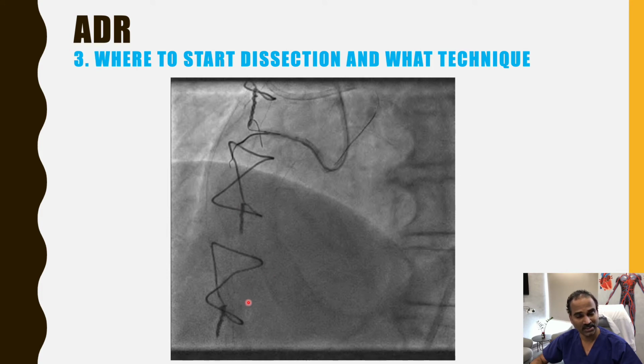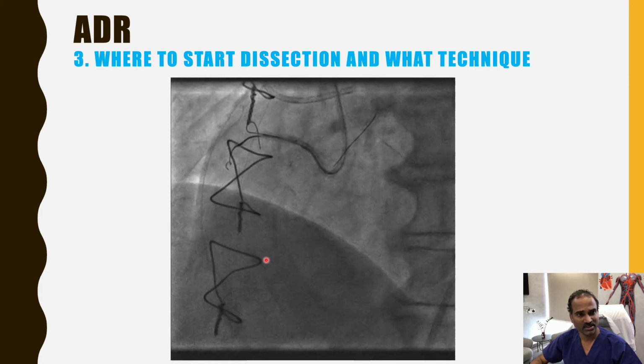We have only a distal reentry zone of 1.7 millimeters in the CT scan. So if your subintimal space is connected to the aorta and expanded, then your reentry becomes very difficult. So this is key, and that's what we did.